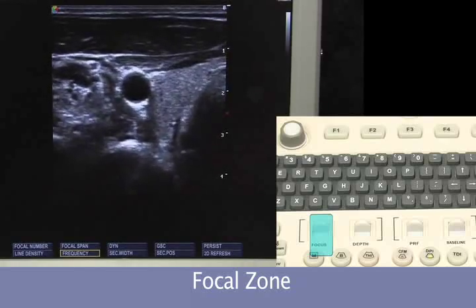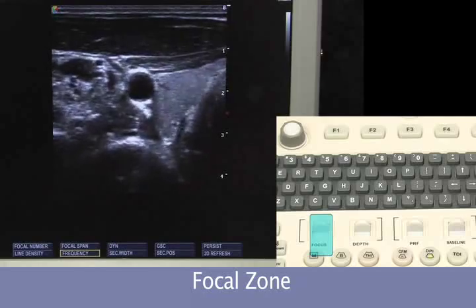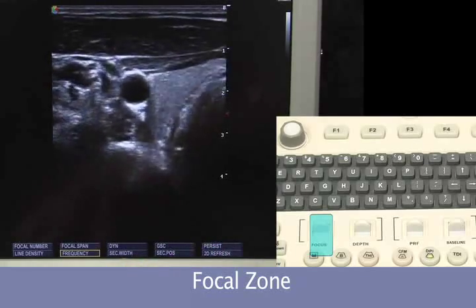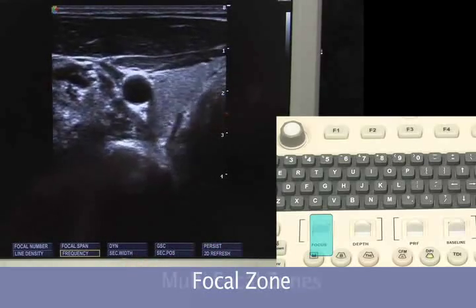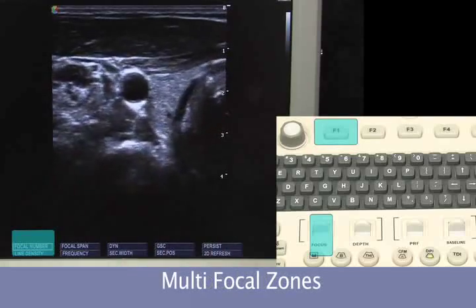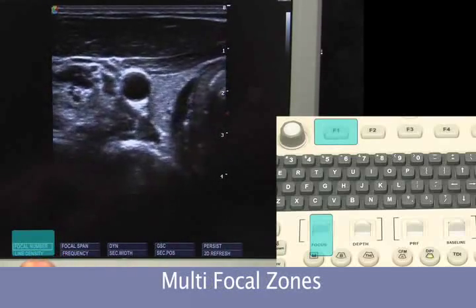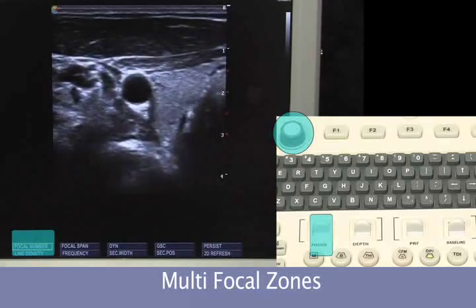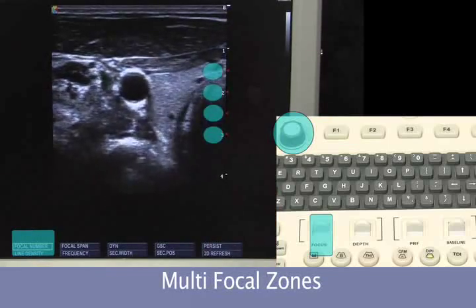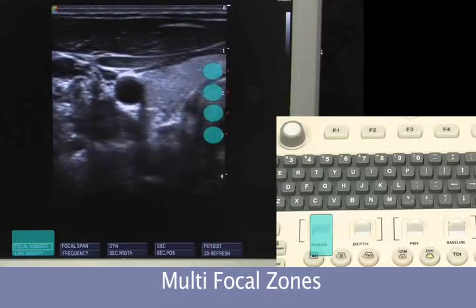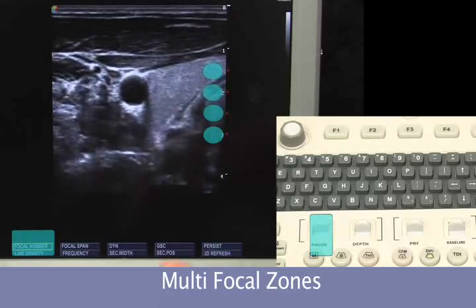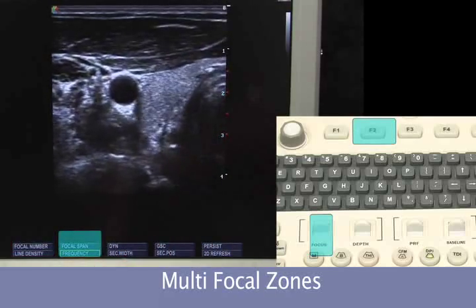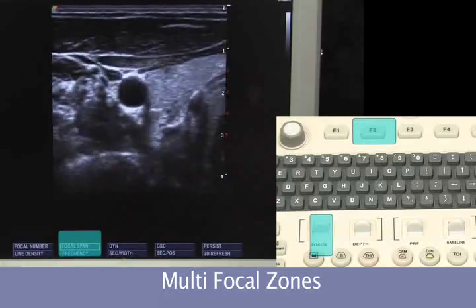Multiple focal zones are available on the unit and can be used because the frame rate is so high. To change the number of focal zones, hit focal number F1, then use the value knob to increase the focal number — here we have four. Next, we can change the span of the focal zones by hitting F2, highlighting focal span.